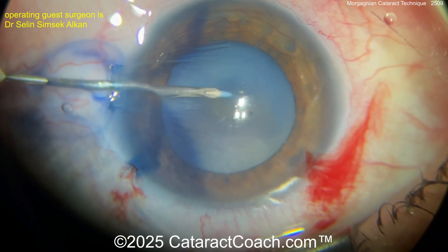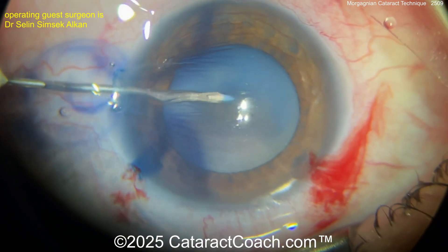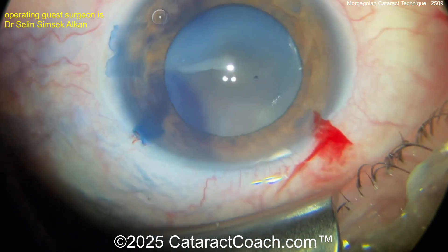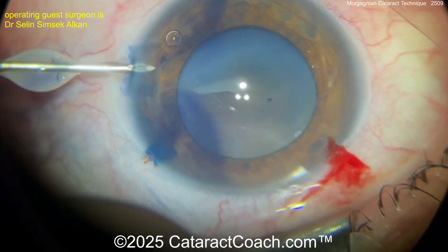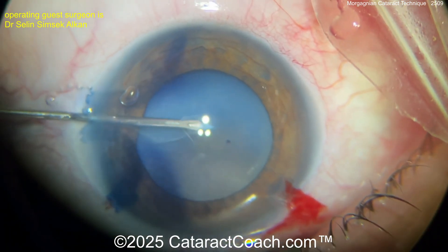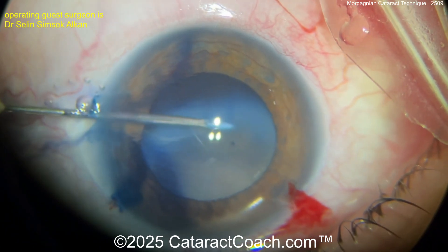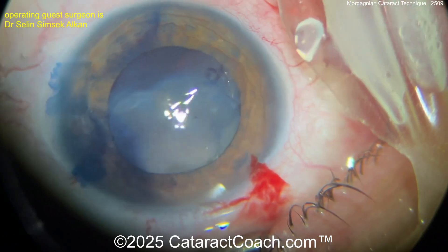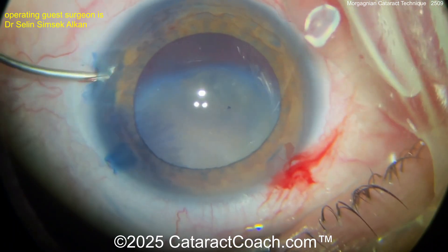In a case like this, so much of the lens material has liquefied and some of it has been absorbed, leaving a central little endonucleus that is now sunsetting. So aspirate out this fluid — look at this, it comes out fast and easy. Oh my gosh, look at all that fluid coming out. All of a sudden you have a view, and now look — you've got a sun-setted lens nucleus.